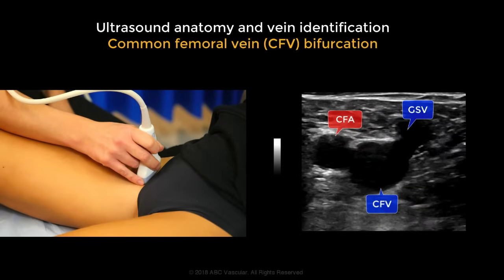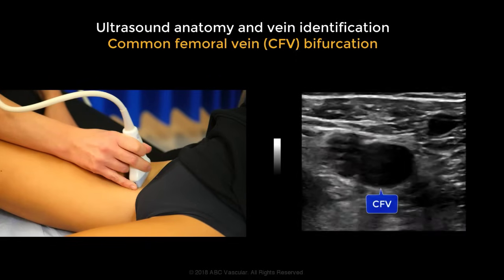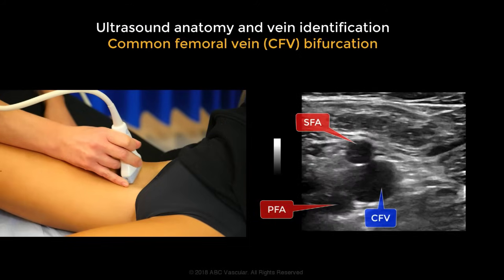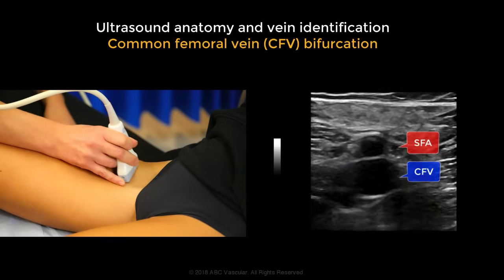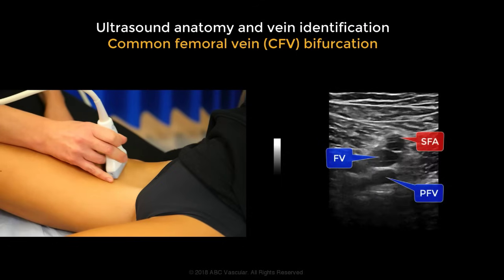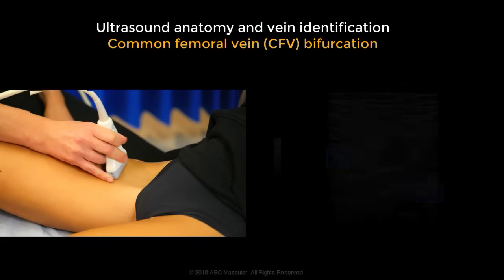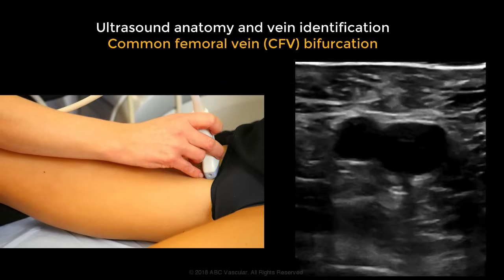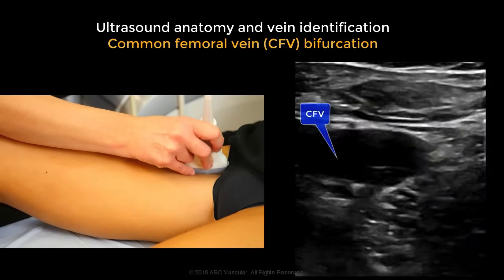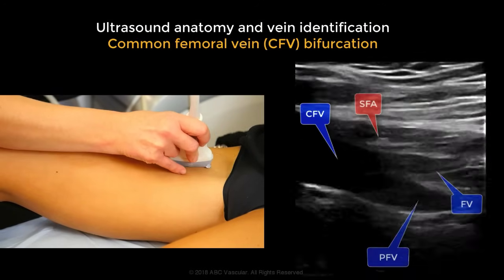Starting from the groin, move the transducer further down to identify the venous femoral bifurcation. We can see the arterial bifurcation first, and then more distally there is the venous femoral bifurcation, where we can see the femoral vein and the profunda femoral vein. By moving the transducer back to the groin using a longitudinal view, we can better appreciate the anatomy of the femoral bifurcation, seeing the common femoral vein dividing into the femoral vein and the profunda femoral vein.